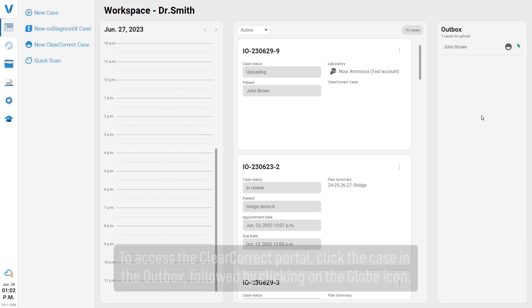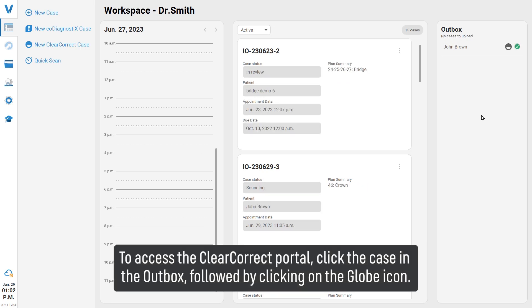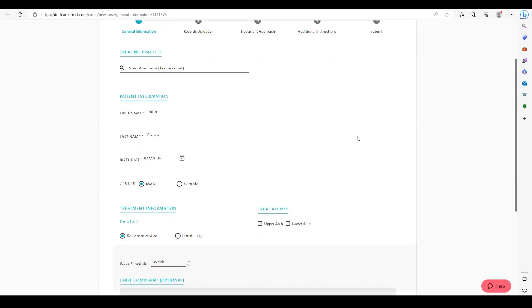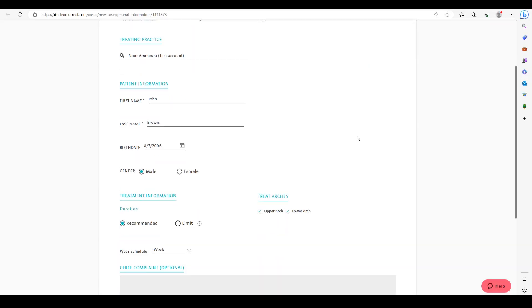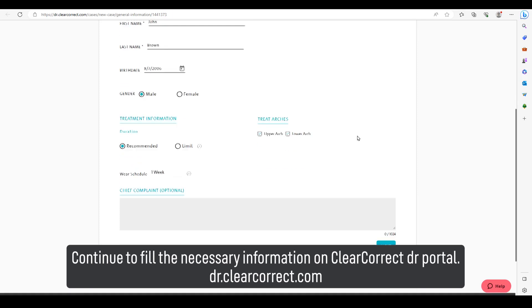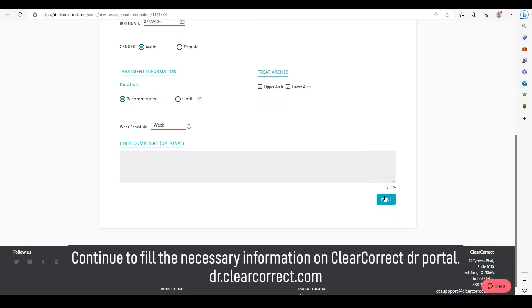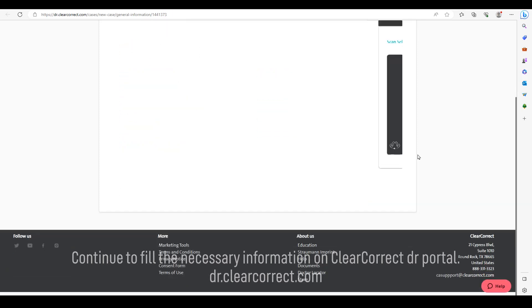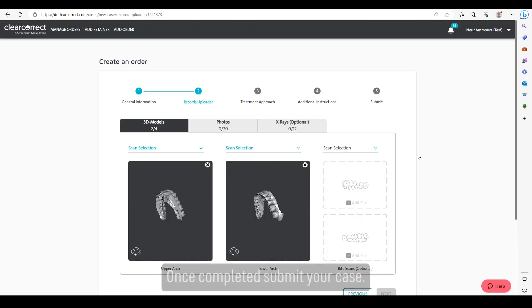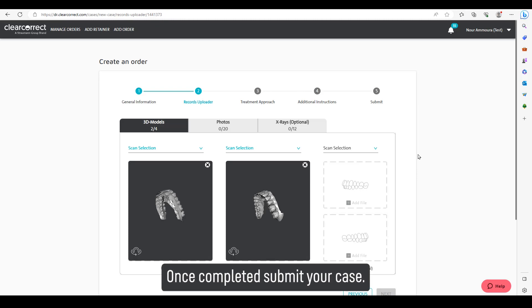To access the ClearCorrect portal, click the case in the Outbox, then click the globe icon. Continue to fill in the necessary information on the ClearCorrect Doctor Portal. Once completed, submit your case.